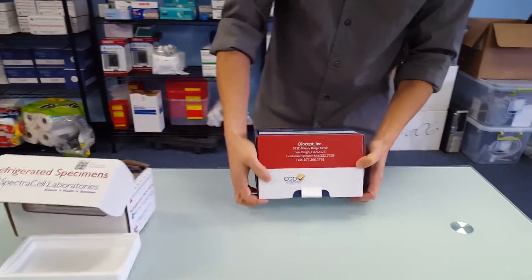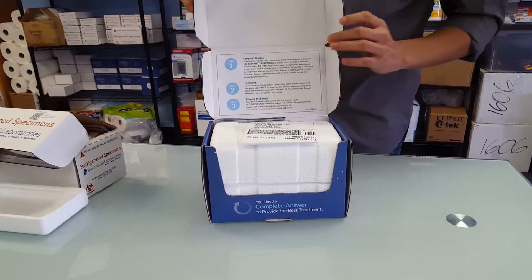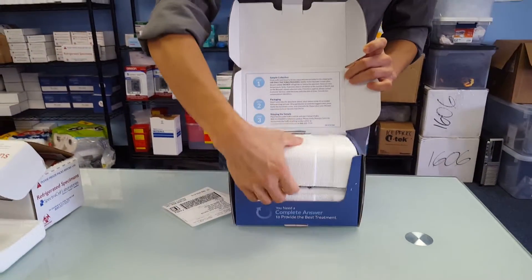This last kit is a very nice kit as well. Very custom-made. It has on the inside right away the collection instructions. You have your return label. Very nice styrofoam container.